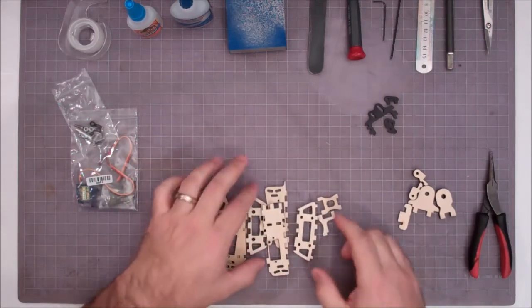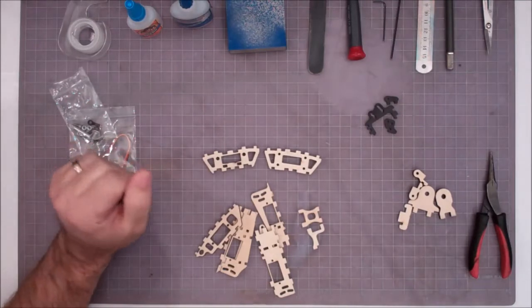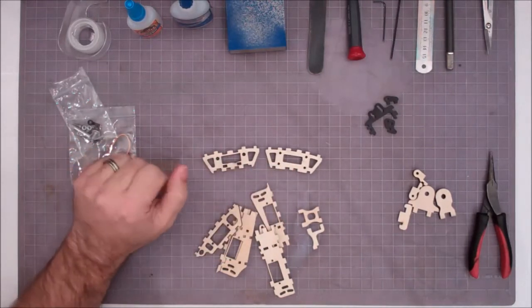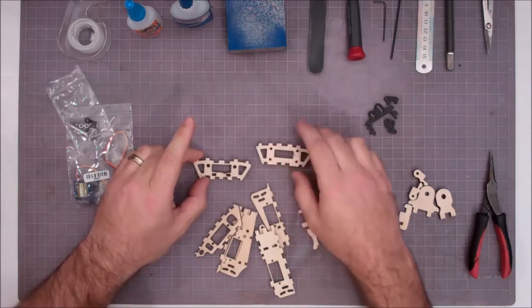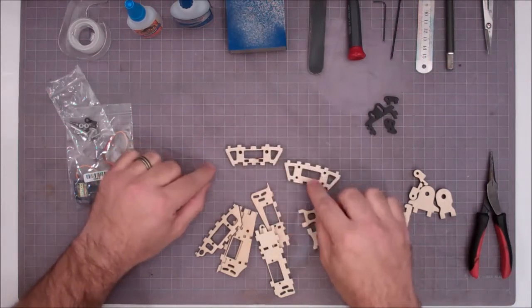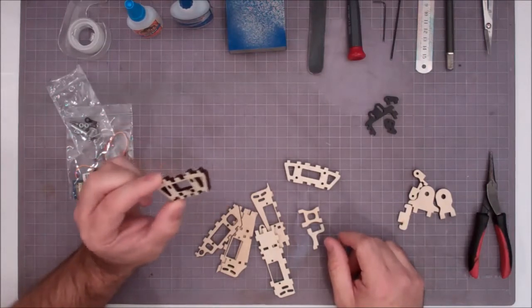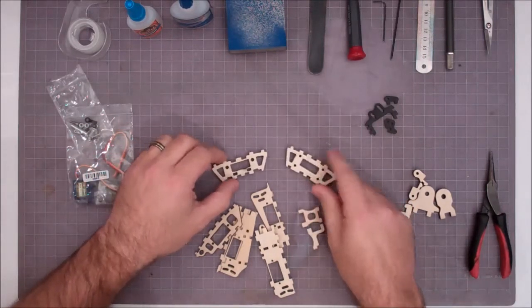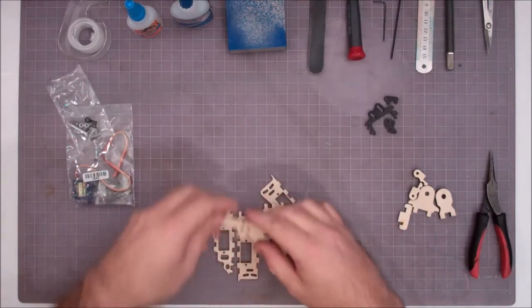the main palm. Now, in my kit here that I'm laying out, you'll see there's 2 of these brackets. Your kit will only contain 1 of them. You'll either have the one with the 4 holes for a hand, or you'll have the one with 2 holes and some slots for an arm. This is for the wrist pivot. This is without the wrist pivot. Okay, and then the plates.